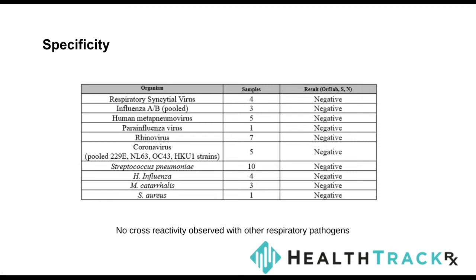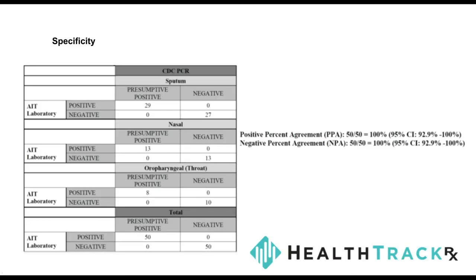we had all of our samples from the 2019 study saved in a deep freezer, and that allowed us to do a good specificity study wherein, for all the other syndromic targets, we found that there was no interference from those. And overall, the specificity of testing a difficult sample type like the sputum samples, as opposed to a nasal or an oropharyngeal swab, put together, the predictive value of our test, both positive and negative, was found to be 100%.